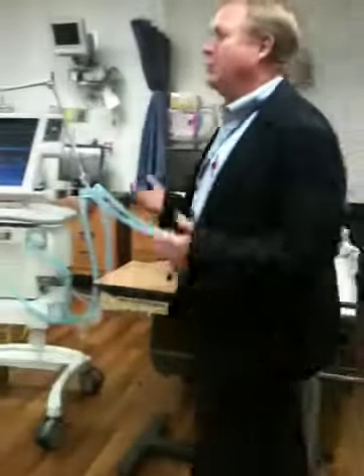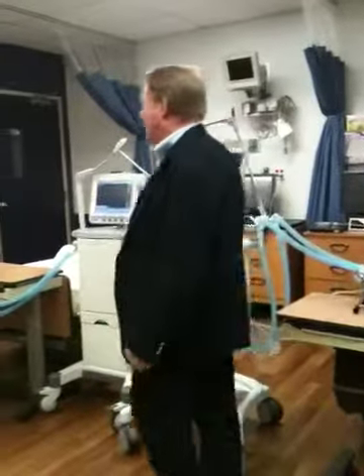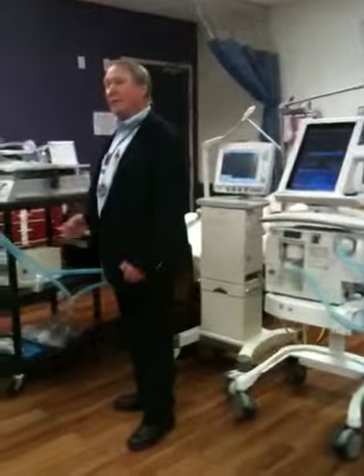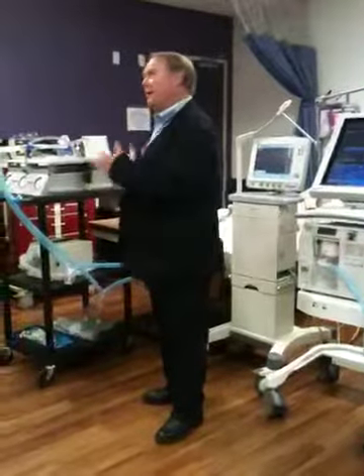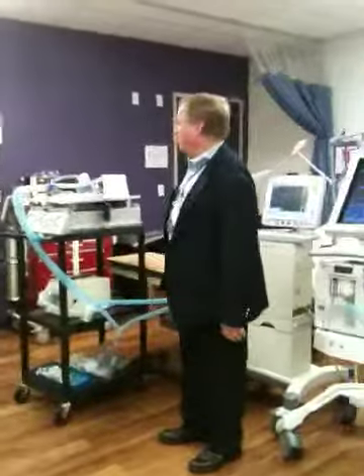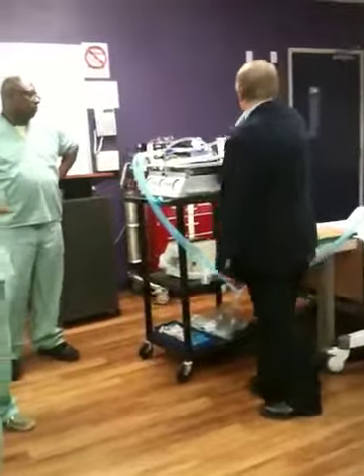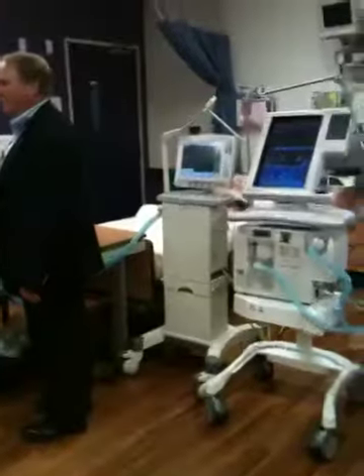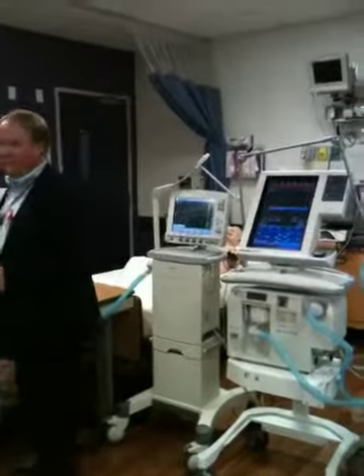This is how we use pressure volume curves, compliance, resistance, because if my patient's compliance changes, I need to know about it. How am I going to assess it? If the patient is going into congestive heart failure, the compliance gets worse. If their pulmonary edema is getting worse, the compliance is going to get worse. If they blow a pneumothorax, one lung is going to get real bad, and compliance is suddenly going to get worse, because now they only have one lung working, and it's eventually going to collapse the other lung.